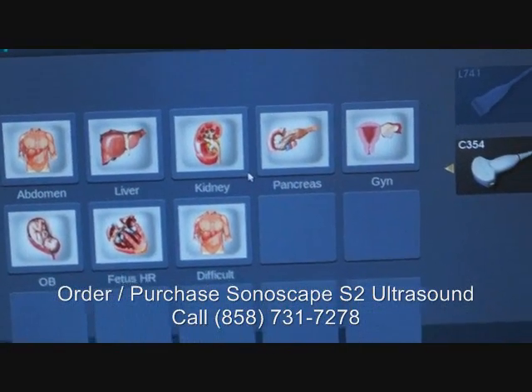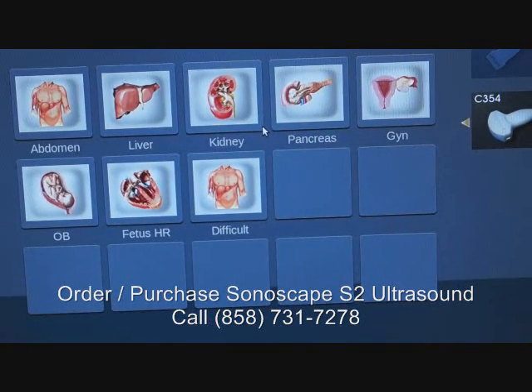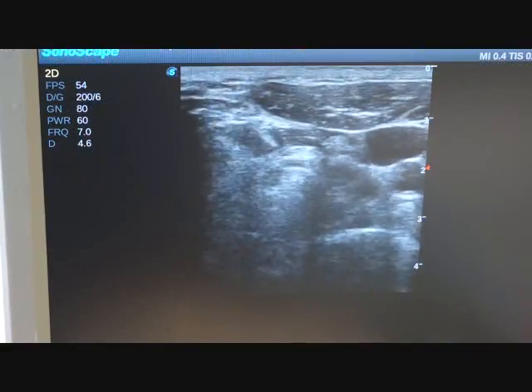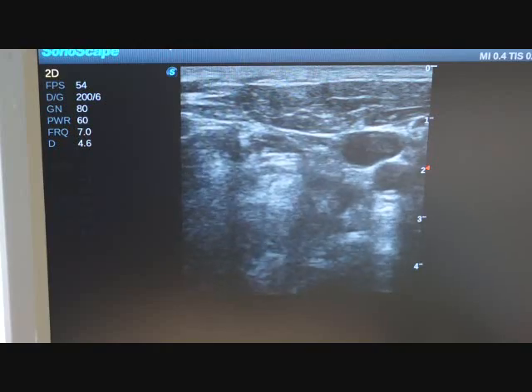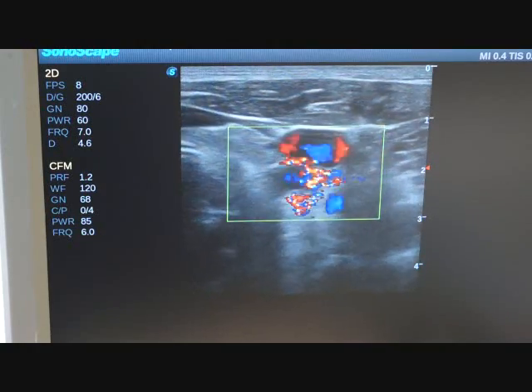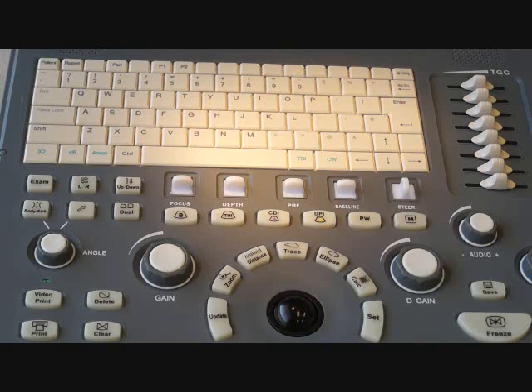We'll zoom in real quick. With the convex probe that we have plugged in right now, you can see it's super easy to get to any of those presets. Go ahead and set that and it will bring you right in and you can start work. The machine makes it very easy to load patient data and very easy to use.